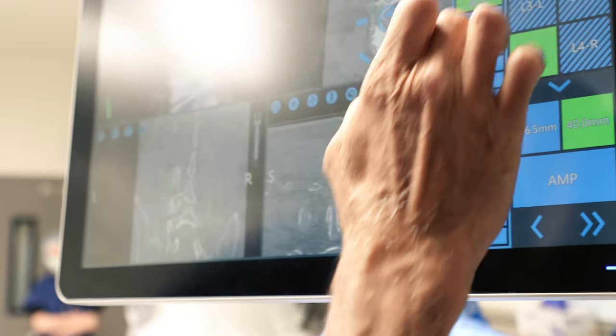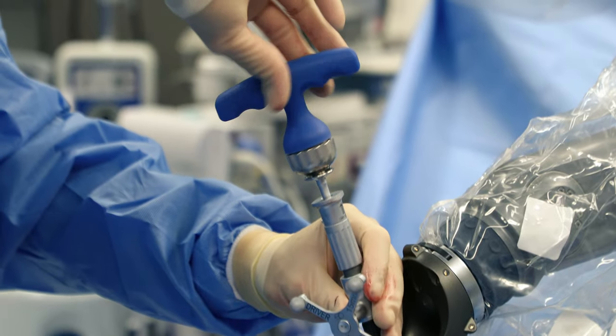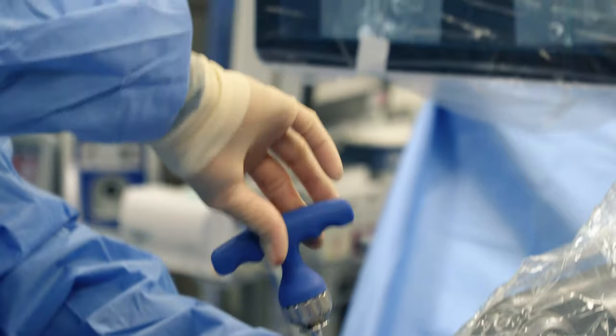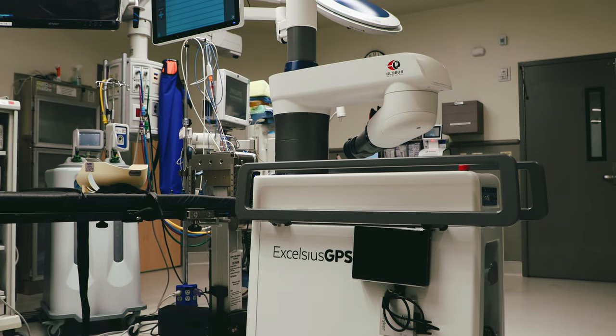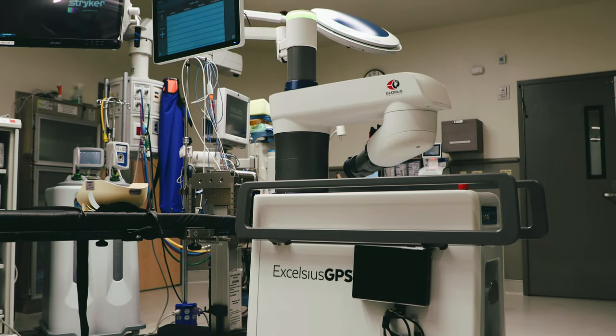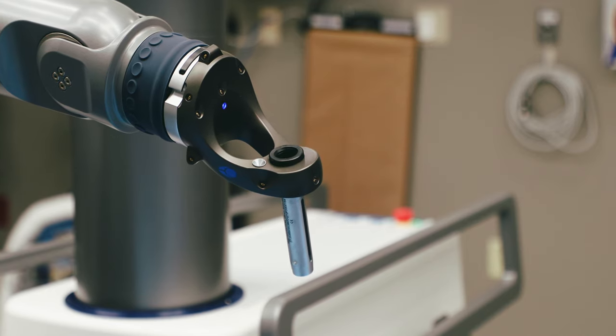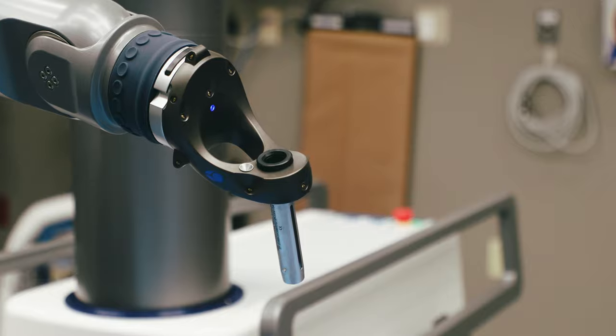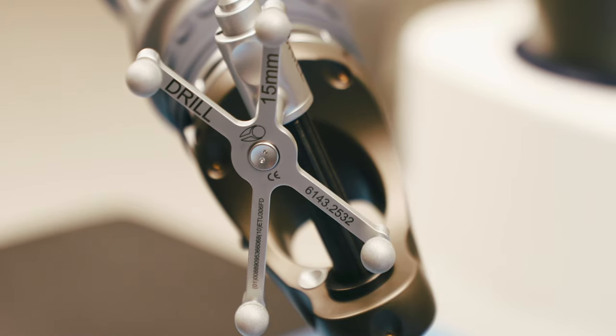Image-guided neurosurgery in the spine integrates robotics, so we now use imaging, robotic techniques, and surgery to treat spine conditions with great pinpoint precision. It's not that you can't do that. I'm not questioning the ability of a surgeon to do this without the robot, but think about it for a moment. It takes away one of the concerns of surgery, and that's precision, pinpoint precision, in the placement of the instrumentation.